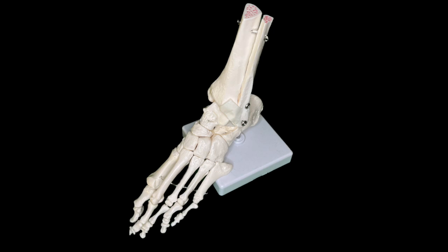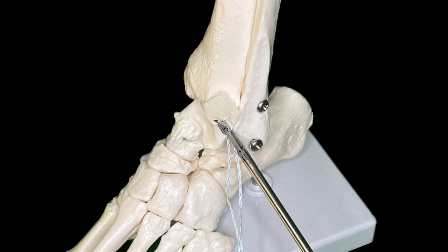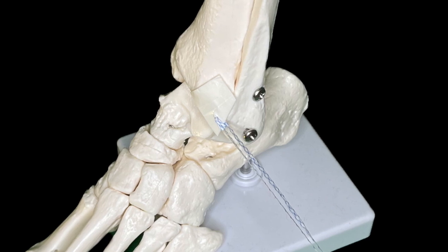This simulates the procedure on an ankle model. The suture tape is passed through the ligament with a mini-scorpion. The loop is pulled out to form a loop suture by introducing one of the tails through the loop and tightened.